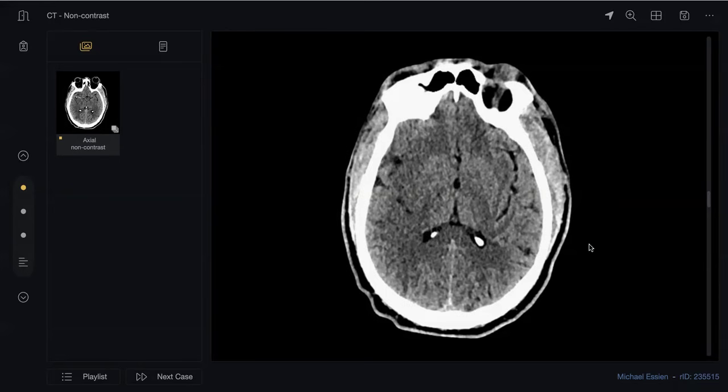What is the penumbra to core infarct ratio to decide for mechanical thrombectomy? I don't know. There should be some mismatch between penumbra and core infarct, right? Yes, significant salvageable tissue. If the ratio of penumbra to core infarct is more than 1.8, it is the criterion to go for mechanical thrombectomy.